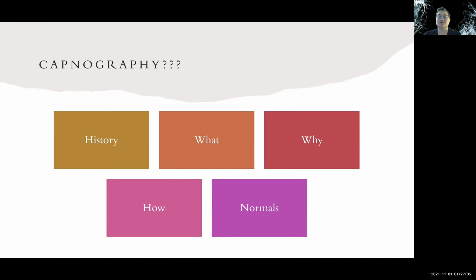Now, CO2 is measured between the patient and the anesthetic machine. There will be a device, the monitor sensor, that's placed between the endotracheal tube, patient end, and the breathing circuit itself. This device is then connected through a sampling tube to the proper monitor that has been calibrated appropriately.